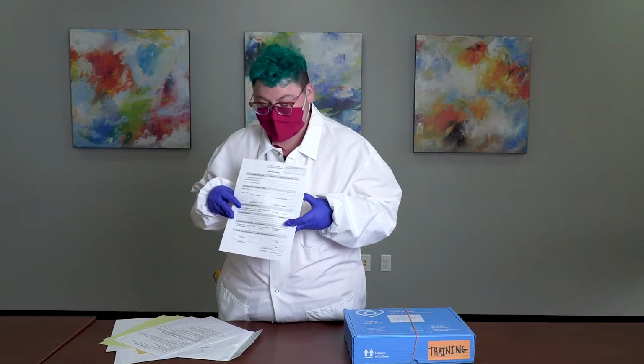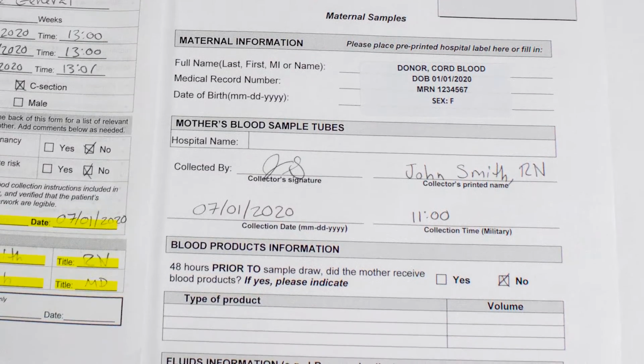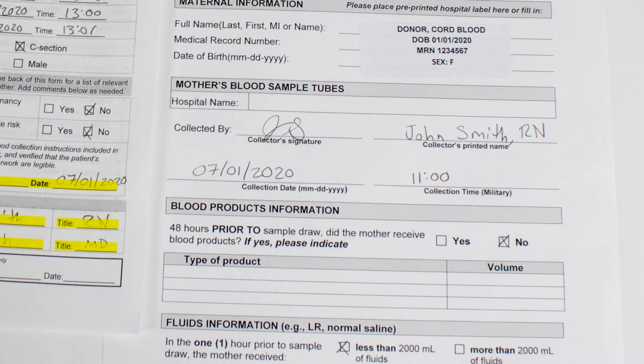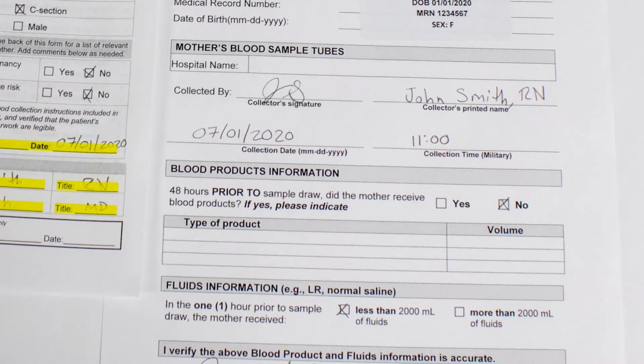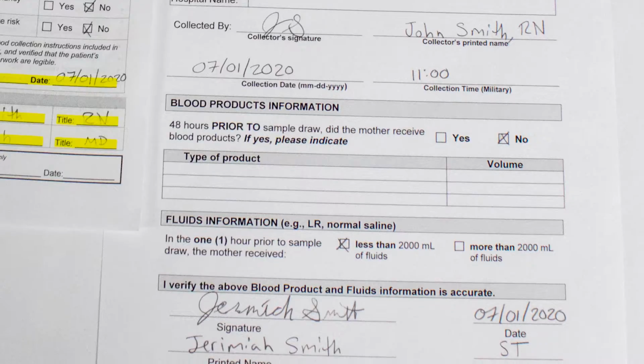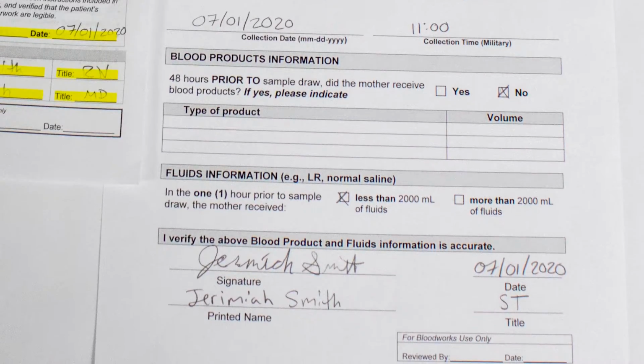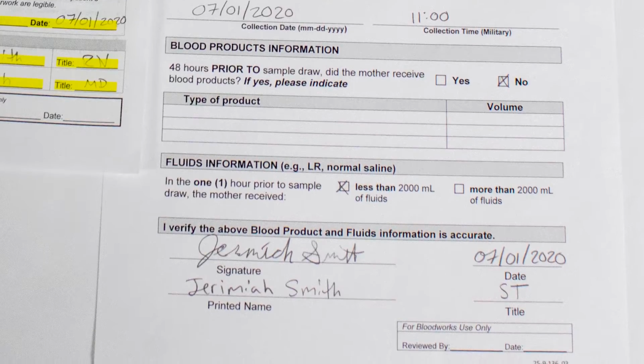The next form for hospital staff is the maternal sample form. Maternal samples can be collected prior to the delivery or after the cord blood collection. This can be completed by the person who does the collection of the maternal samples. So that could be a nurse or phlebotomist or another lab tech. The bottom of the form is verifying that the information listed above is correct.